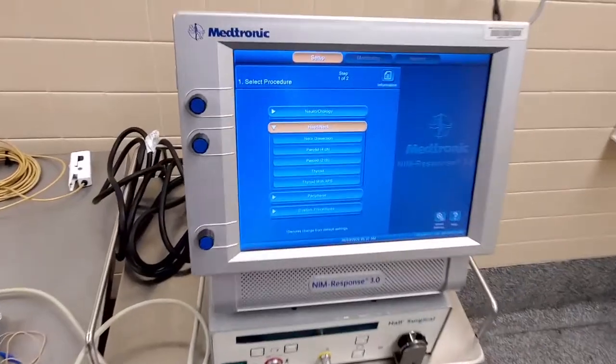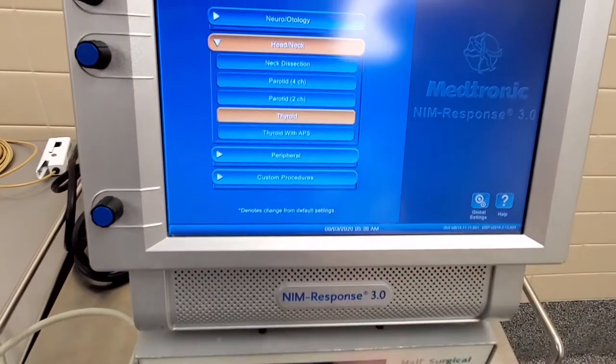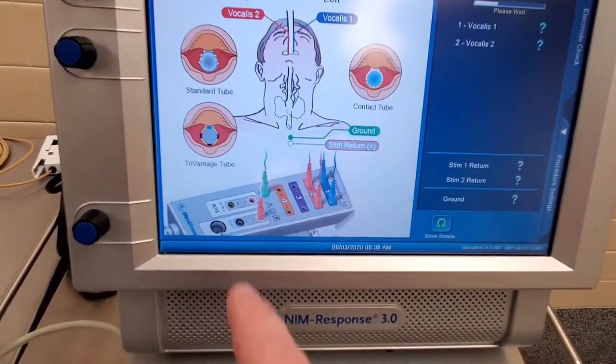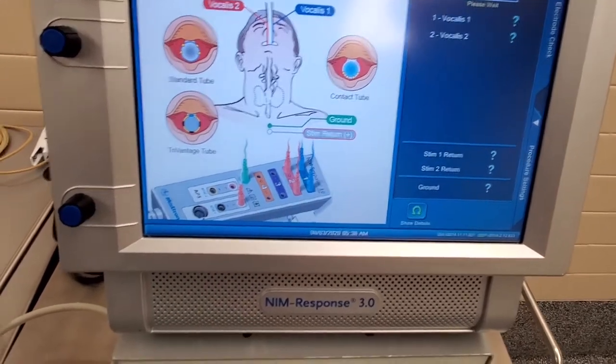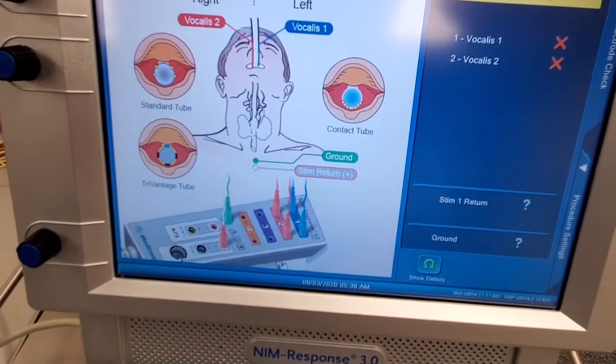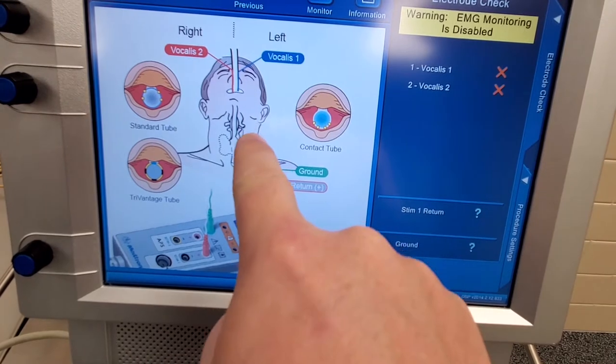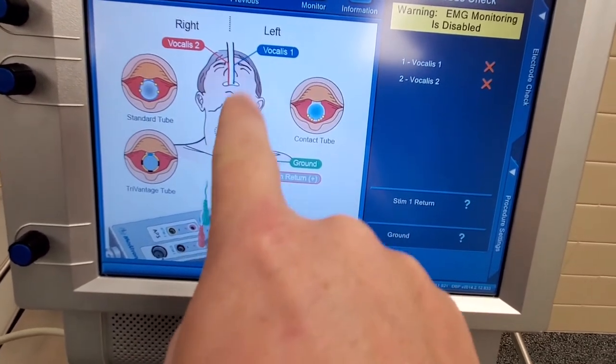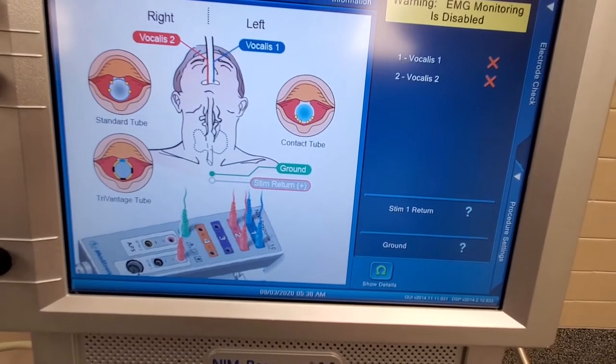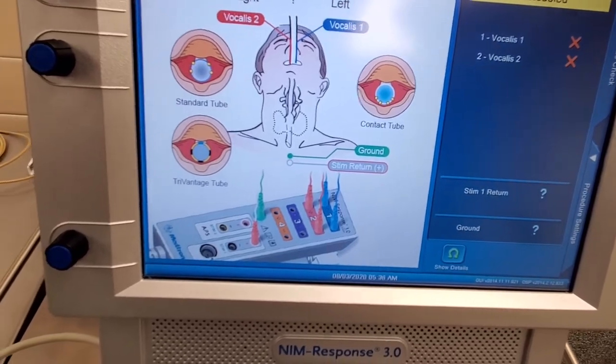You can see when you boot it up, there's a series of different pre-programmed cases. So let's do a thyroid. You can see here they show you a visual demonstration of what the pendant should look like and where you're going to place the nerve detections. Here they're using a very special endotracheal tube which has got the electrodes already implanted into the tube, so you just have to make sure that the tube is in the correct place and then it will pick up a signal.